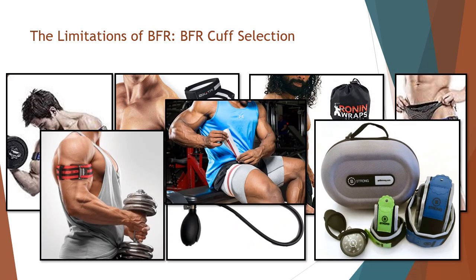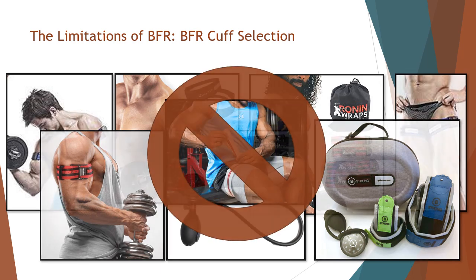If you type it into Amazon or Google browser, you're going to get a wide variety of non-regulated cuffs that, one, are borderline unsafe at worst, and certainly they may not even potentially be effective, as we know the importance that exists within the creation of the hypoxic environment, and that the pressures that are utilized need to be specific not only to the individual but specific to the limb even, and there's no way to regulate the amount of pressure that is being applied to these limbs with these cuffs. So that's kind of a no-go.